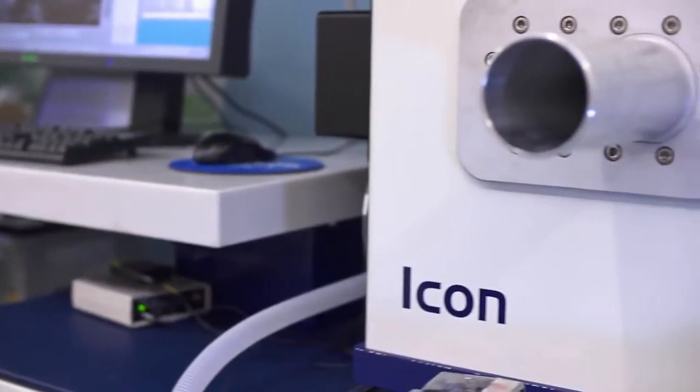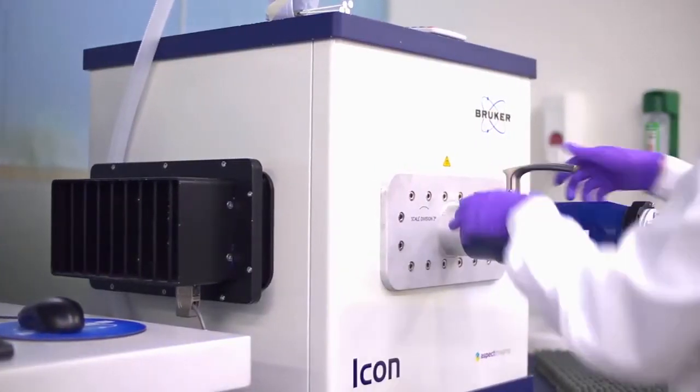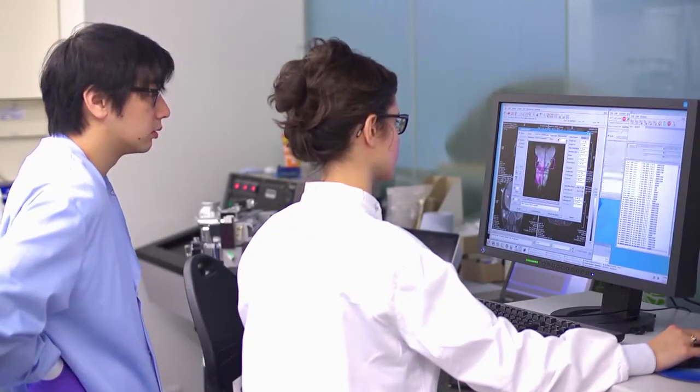There is a place for the ICON, I would say, because it takes up much less space compared with a 9.4T system, whereas the desktop system can just sit in the corner of most biomedical imaging or even biomedical labs.